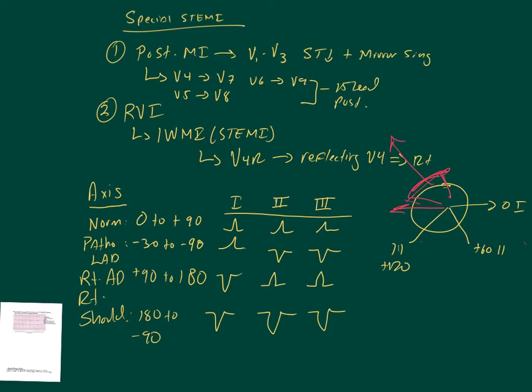And then finally, that brought us into a discussion about STEMI mimics. And what were the mimics that we've talked about so far today? So benign early repolarization, right? We said it's a normal variation, generally younger people, generally causes a mild, widespread or diffusely spread ST elevation. What does it look like though? Concave. The J points are elevated, notching at the J point, good. You guys okay with that?